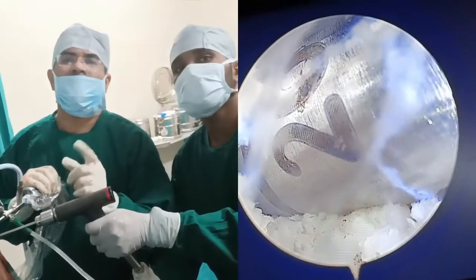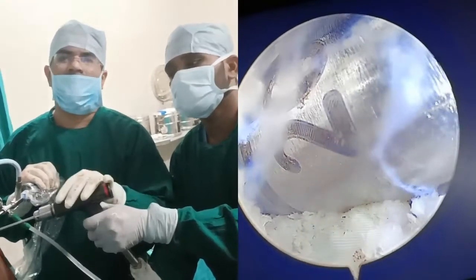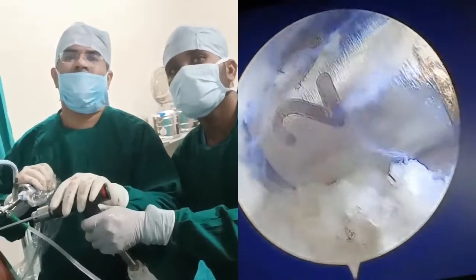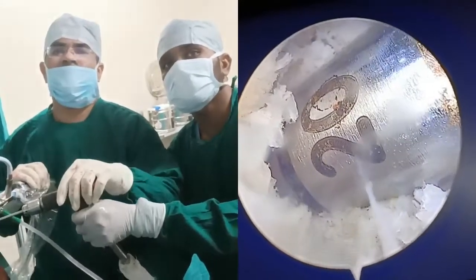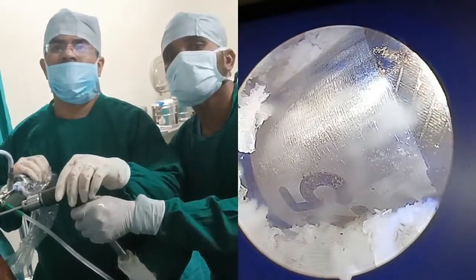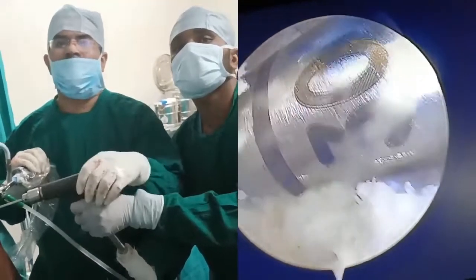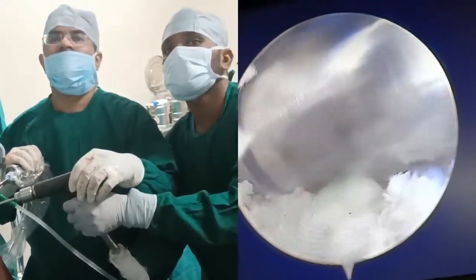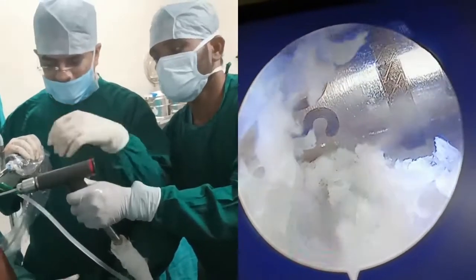We are already done with the endobutton reamer and now we are going with the 8 mm reamer. I am already done at 20 mm, now slowly going — this is 25 and this is my 30 mark, so I have gone up to 30. Now I slowly remove it.